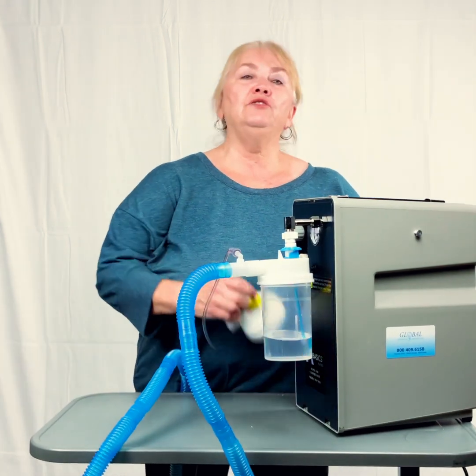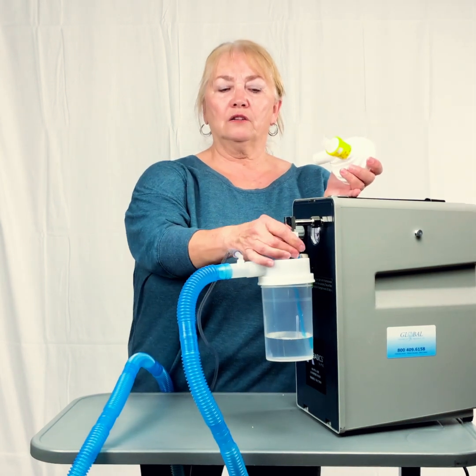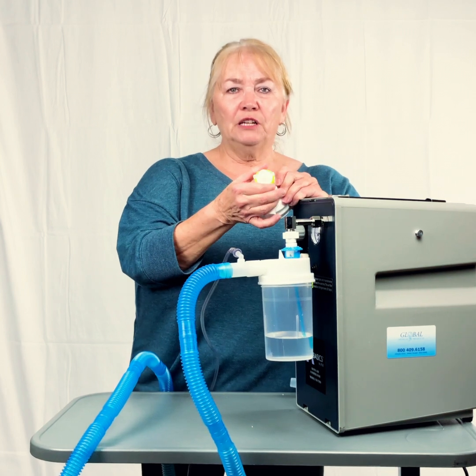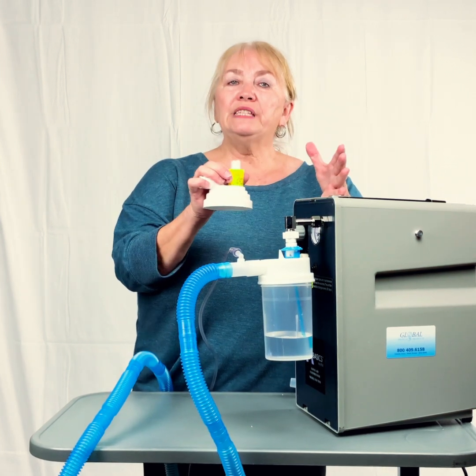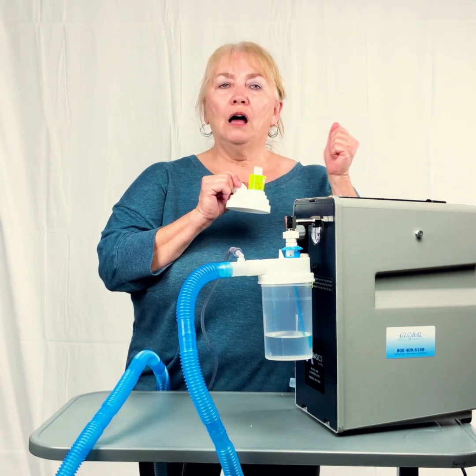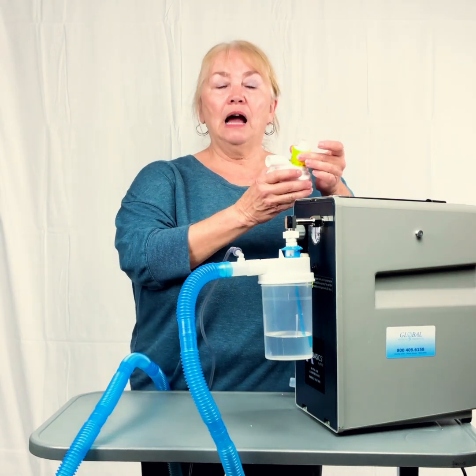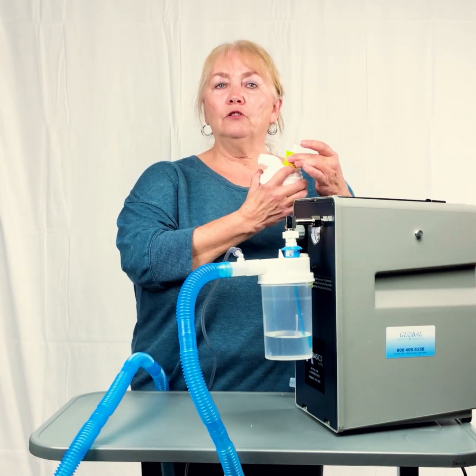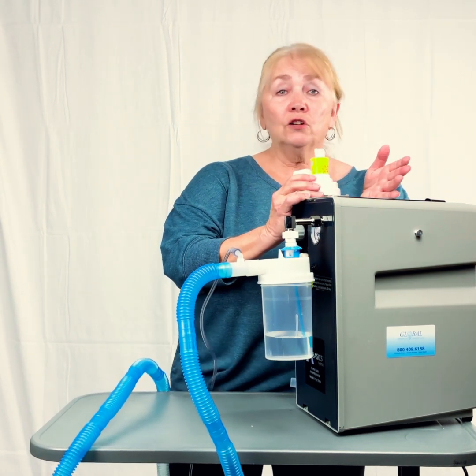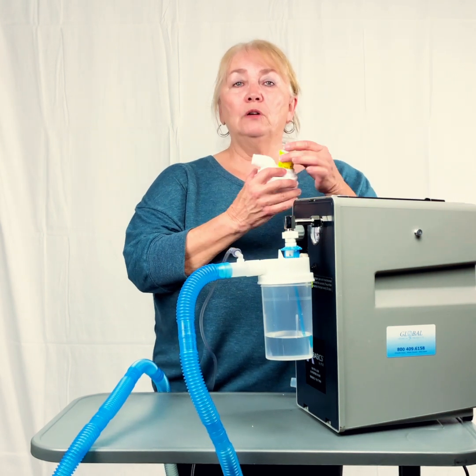One of the first things that you need to realize is that the numbers on the top of any of the water bottles, these neb bottles, does not determine how much oxygen the patient's getting. In the home setting and in some facilities, they are not using wall oxygen like is in the hospital. If we were in the hospital, yes, I would set this, point the little arrow to whatever oxygen flow I wanted. But in the home setting, or again, in some long-term cares that don't have piped O2, all this does is determine how much of a mist we have.